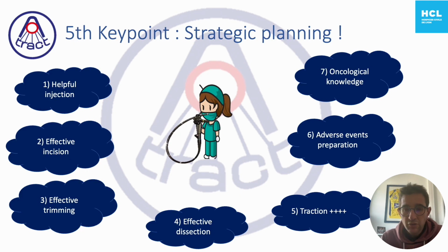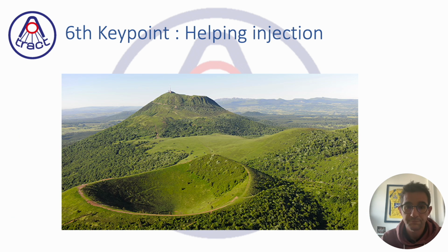All my a priori strategies are here, but after we will try to adjust. And after, we will try to have the perfect ESD during the procedure. I mean, we will do the helpful injection to help your strategy, an effective incision, an effective trimming, an effective dissection, a traction, which helps a lot, adverse events preparation, and oncological knowledge after the resection.